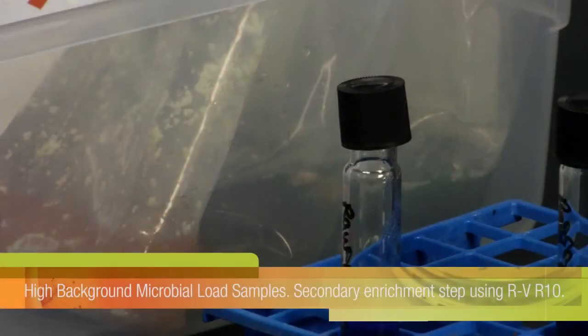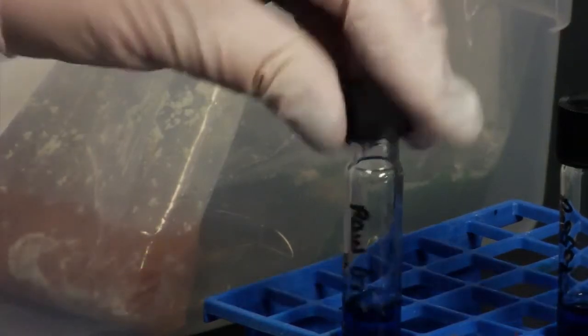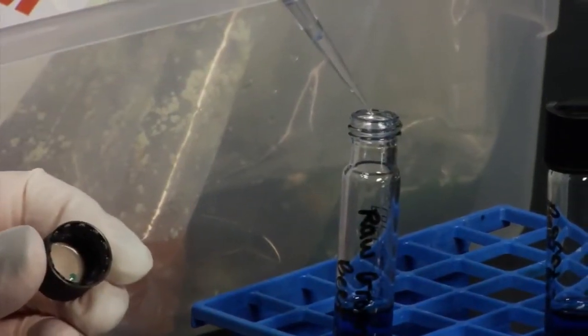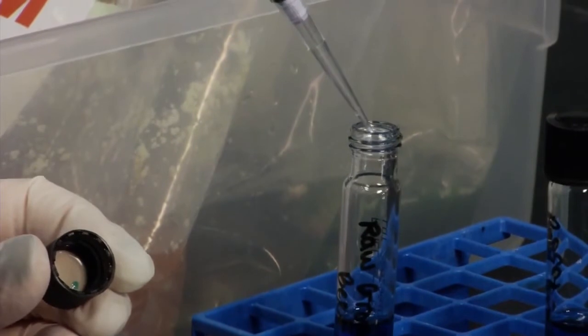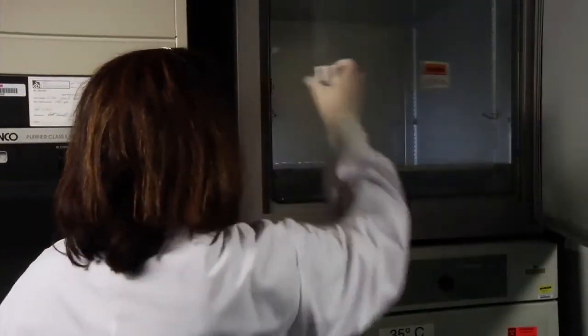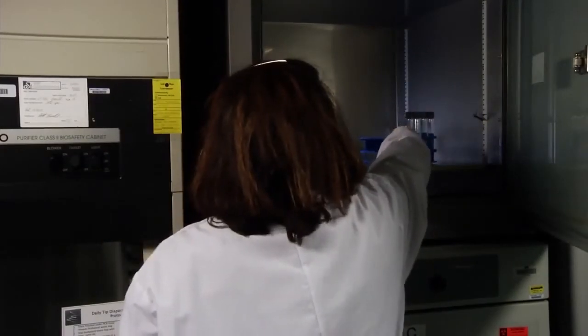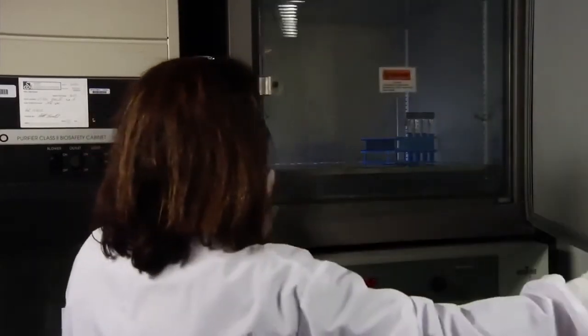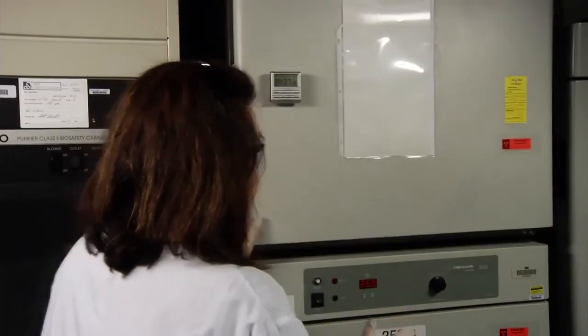For high background microbial load samples, perform a secondary enrichment step by transferring 0.1 milliliter of enrichment medium to 10 milliliters pre-warmed 3M RVR10 broth. Incubate the RVR10 at 41.5 degrees plus or minus 1 degree Celsius for 8 to 24 hours. The incubation range allows for laboratory flexibility.